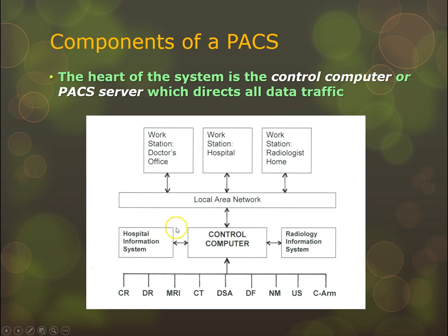You have the hospital information system, the radiology information system, and it will talk back and forth using DICOM work list. That's how it will communicate with all of these. And it also talks to the local area network and these workstations. So it's at the very heart. It speaks a language called DICOM, which we'll talk about in a minute. And it's the heart or guts of the system.